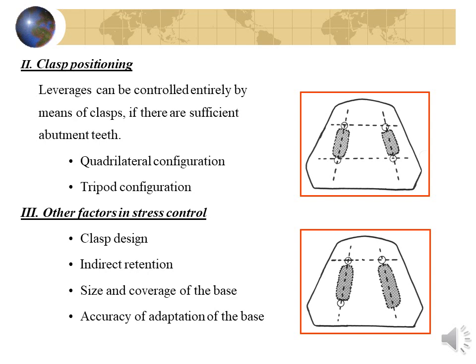The denture base should have a long flange in order to stabilize the denture against horizontal movement. Distal extension denture bases must always extend onto the retromolar pad area in the mandible and cover the entire tuberosity in the maxilla. A functional impression should be recorded to fabricate the denture in order to improve its adaptation and avoid excessive tissue displacement.